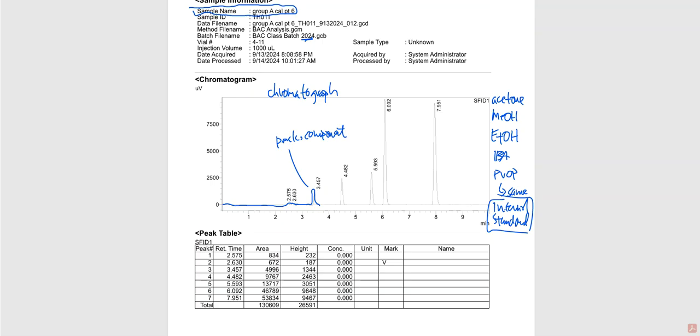All right, so that propanol, the value should not change. And that value that we are focused on will come from the area column. That is where we're going to be using these numbers, doing something with those numbers. I'm not going to do it all for you, but I'll do enough of it where I think that you'll feel a little bit better about what's to come in the spreadsheet.